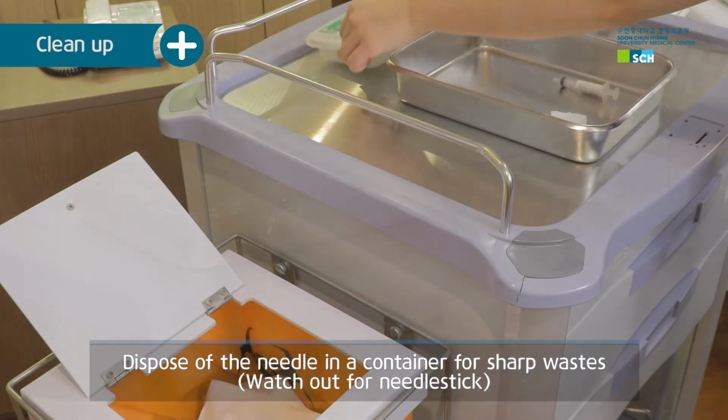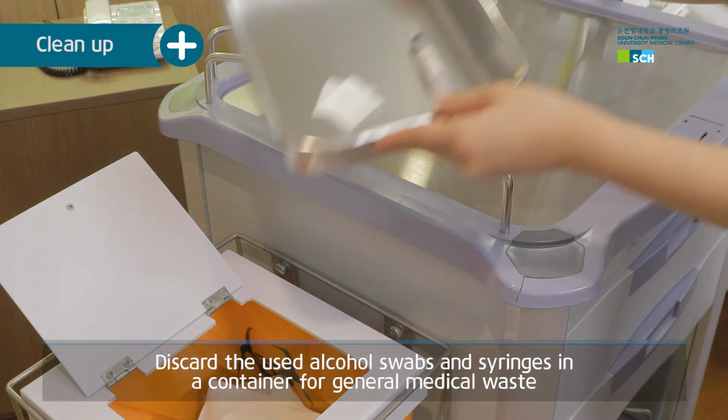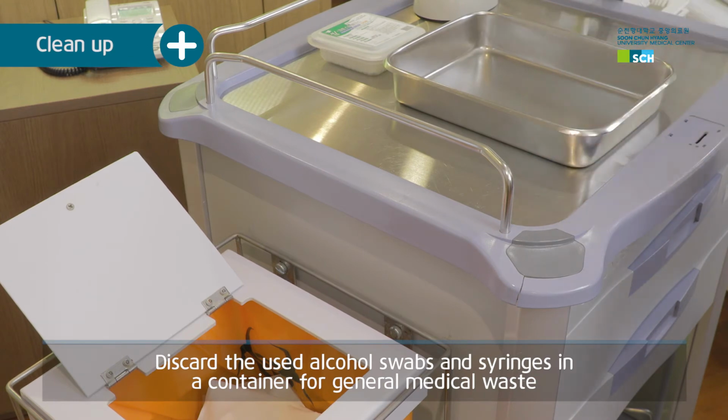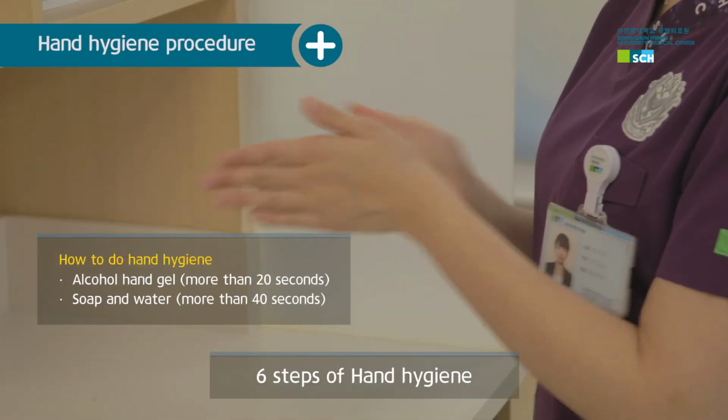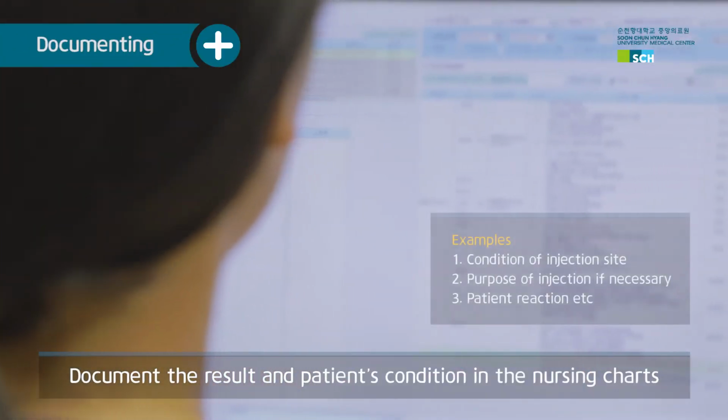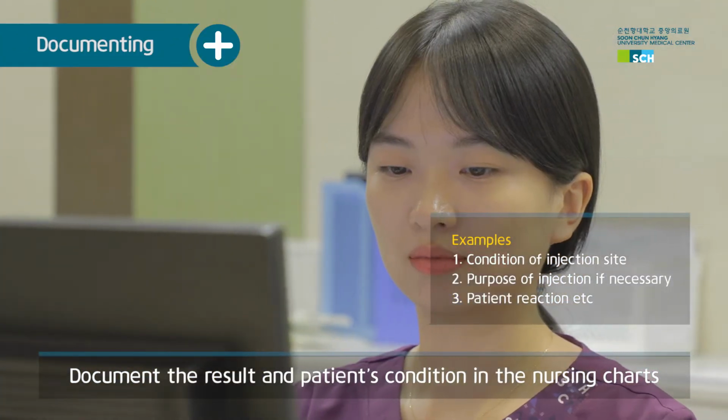Dispose of the needle in a container for sharp wastes, and discard the used alcohol swabs and syringe in a container for general medical waste. Perform hand hygiene. Document the result and patient's condition in the nursing charts.